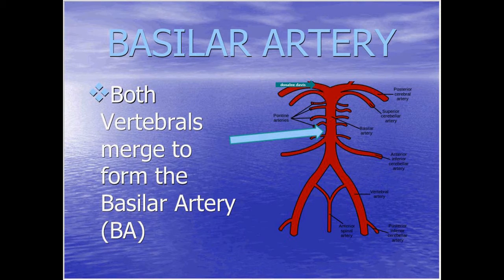Now, when you're doing the posterior circulation, a lot of times, especially people that do the non-imaging, I'll get calls and people will say, well, you said flows are going away from the probe back here. But when I'm doing my basilar, and I know it's my basilar because I'm deep, I know it's not a vertebral, I'm getting flow coming towards me instead of away. So I'm getting both flow towards and away. What is that? The answer is, it's these tiny little pontine arteries that are coming off of the basilar. The basilar looks like a millipede, if you think about it. There are many, many vessels coming off of the basilar artery here, okay? So that's what they are, and you just want to ignore them. You can't make them go away. When we're doing vertebrobasilar evaluation, we want to look at everything going away from the probe. So those verts will be going away from the probe as well as the basilar artery.